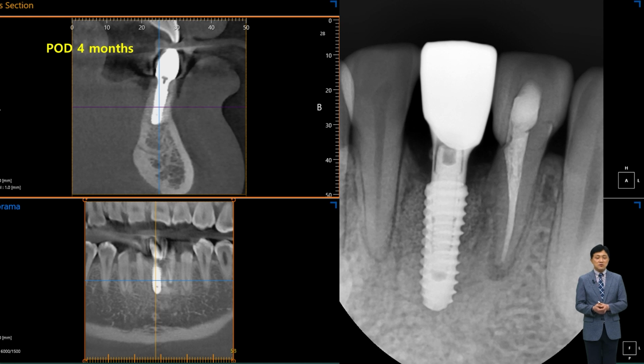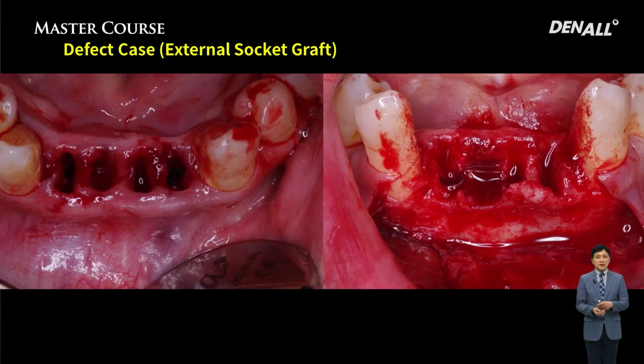In the anterior mandible, the maximum implant diameter that can be used is 3.5 millimeters. Even when buccolingual bone width is thick for a patient, I believe if you use a thick implant, prosthetically it will be very challenging and there will be a problem in the interdental bone. So 3.5 millimeter would be the maximum that you can use.